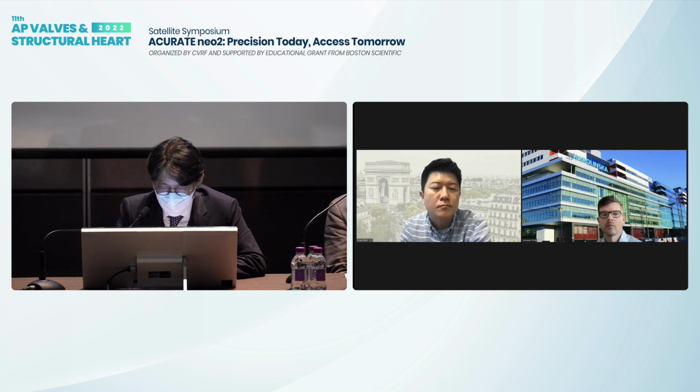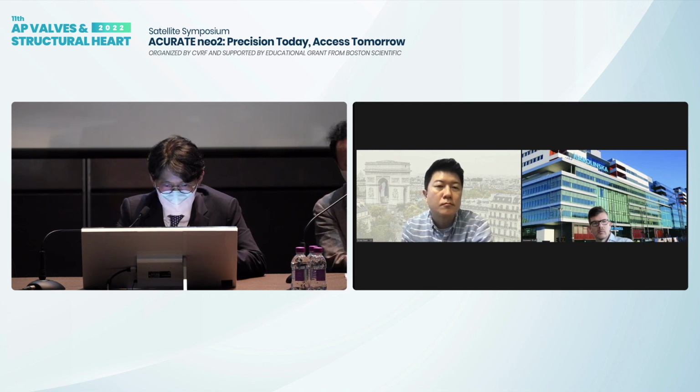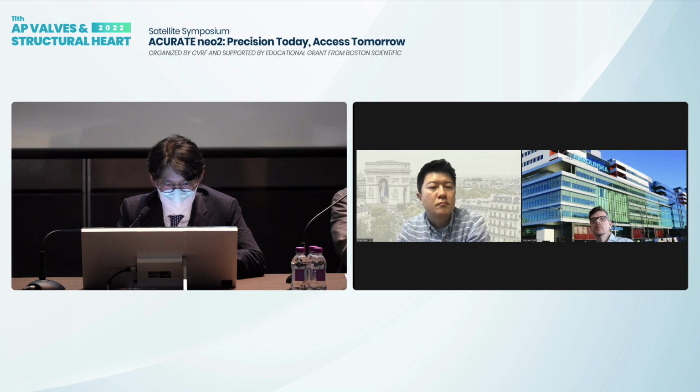Usually, I personally think balloon expandable is well predictable regarding oversizing and undersizing and has well-documented positioning, and the other one is self-expandable. It has unique positioning in hemodynamically unstable and bicuspid anatomy, and sometimes in low coronary height. We have a lot of experience with correct positioning of the self- and balloon-expandable valves. So what about correct positioning of the ACURATE Neo in the Korean situation?